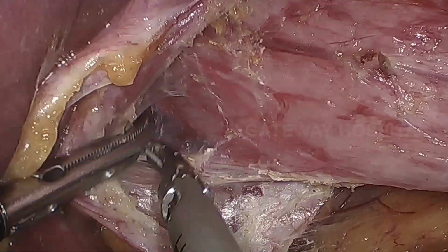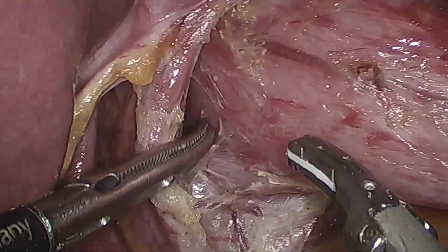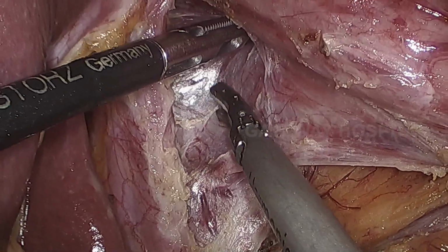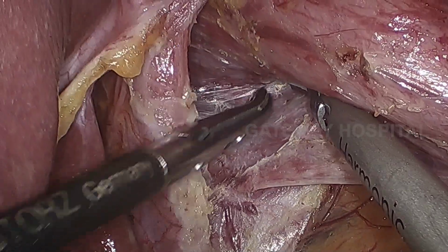So while doing this, you should make sure that you are not injuring the right pleura, and while doing posterior dissection you should identify the course of the posterior vagus in order to avoid injury to the posterior vagus.